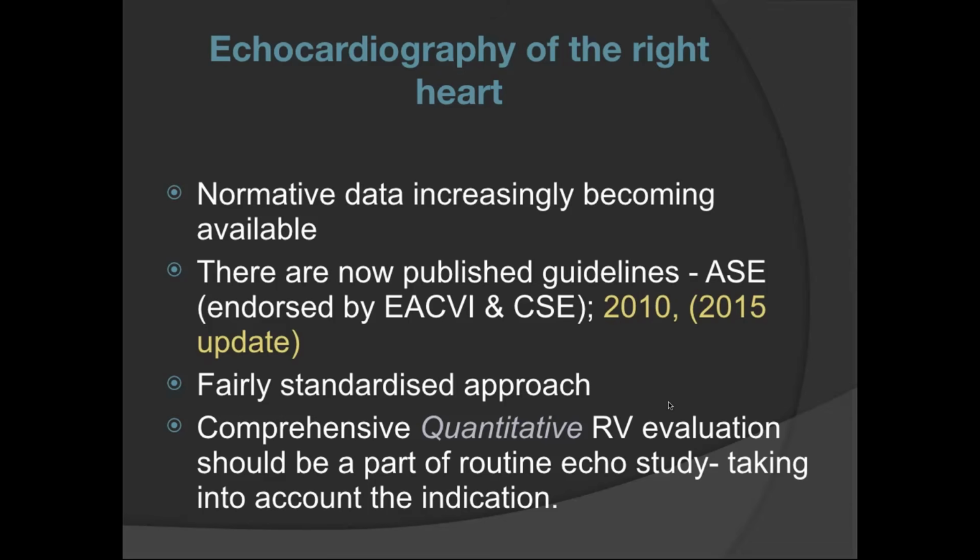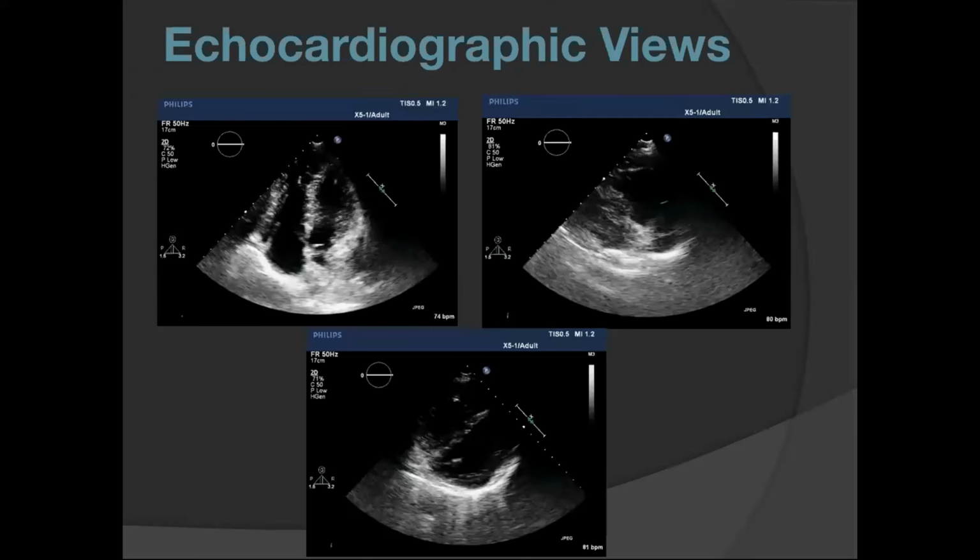If you look at the older reports from even the premier institutes of cardiology in the country, there will be no mention of IVC and no mention of right heart parameters. But now the guidelines say that there should be at least one RA parameter, RA size, and one RV parameter of size, and RV function, along with RV systolic pressure, if TR is there, incorporated in the normal echo reports of all patients. Having said that, more detailed evaluation of the right side should be done if there is a pertinent indication towards looking at the right side in greater detail.